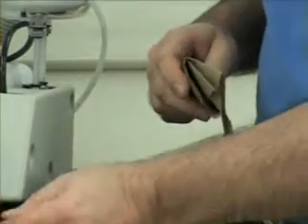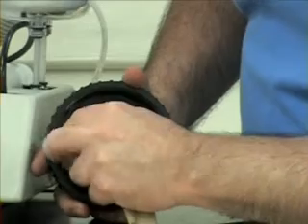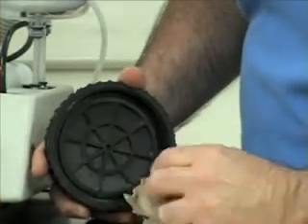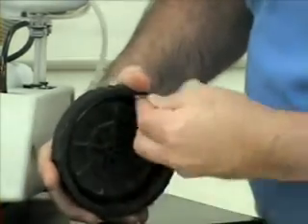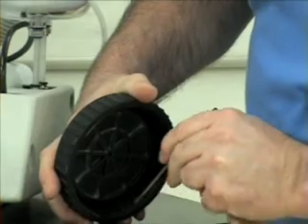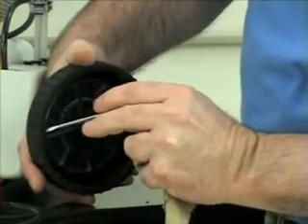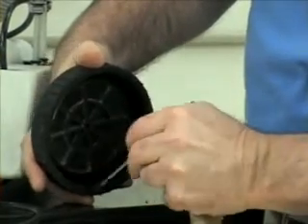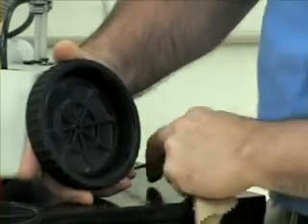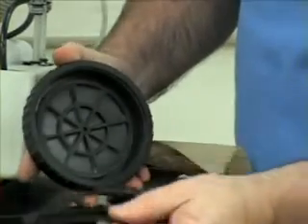Okay, now I'm going to set this aside for a second, and I'm going to go back to the lid, and I'm going to inspect the groove and any bead accumulation inside the groove. I'm going to wipe that out as well, and I'm also going to wipe around here on the threads, and if there's any really stubborn caking inside the threads, I might just take this and lightly run it through the groove and get the caked beads out of the groove. Okay, not too much pressure, but just something to get the caked beads out of the threads. That'll make your life a lot easier screwing the lid off and on, and it also makes for a better seal. One last wipe with the towel, and now I'm going to replace the ring in the lid.